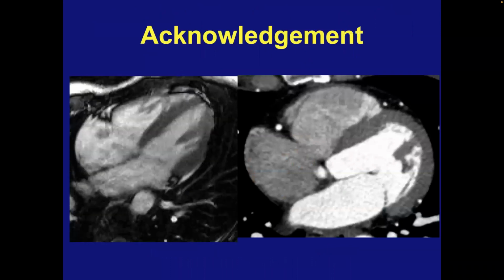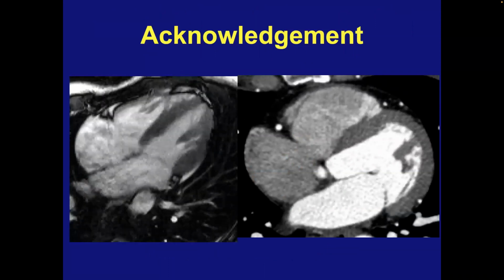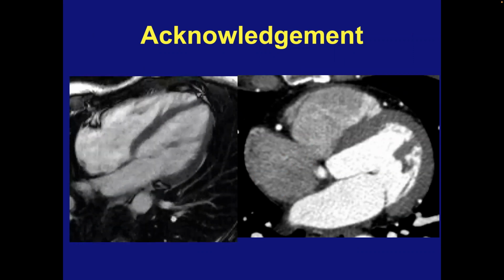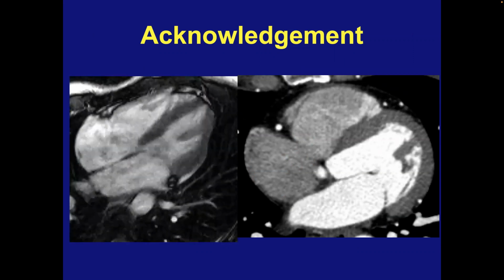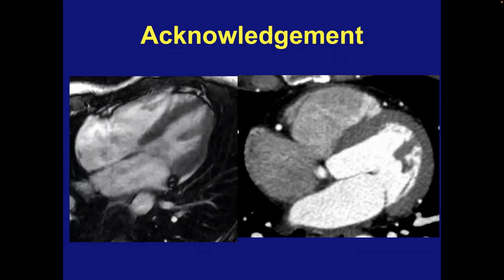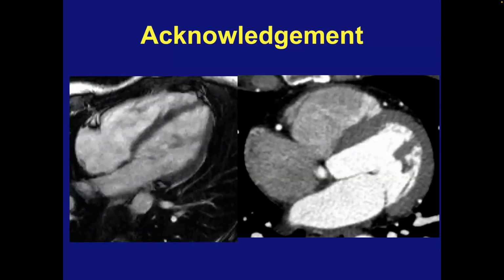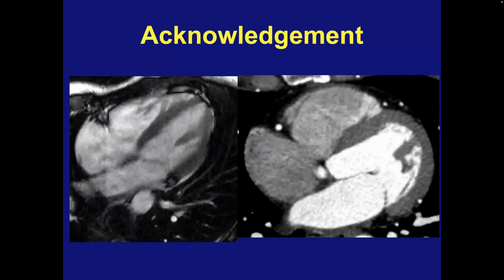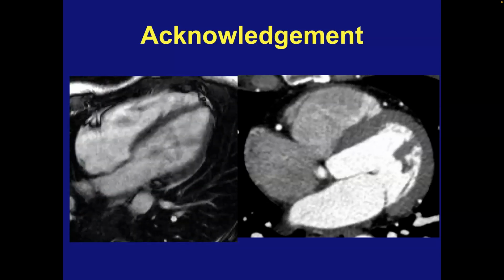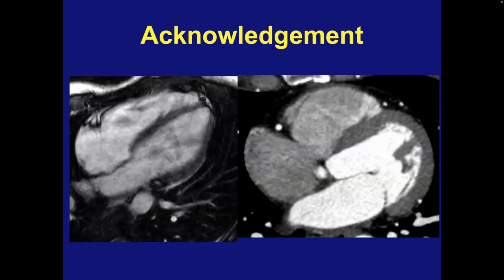So in this day of echocardiography and cardiac MR and cardiac CT, why should we spend time learning about cardiac imaging on the radiograph? Well, remember that chest radiographs are still the most commonly ordered radiologic study. So I think from a patient care standpoint, it's incumbent upon us to be able to recognize abnormalities on the radiograph so as to know when to recommend a cardiac workup, including more advanced cardiac imaging.